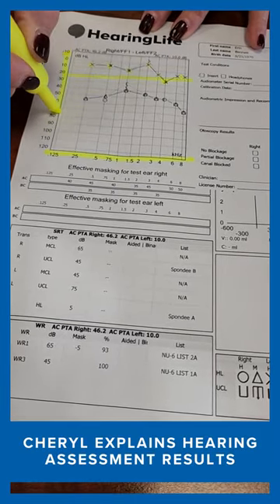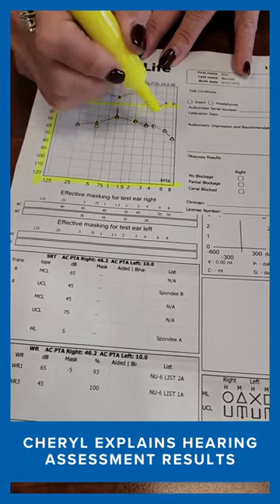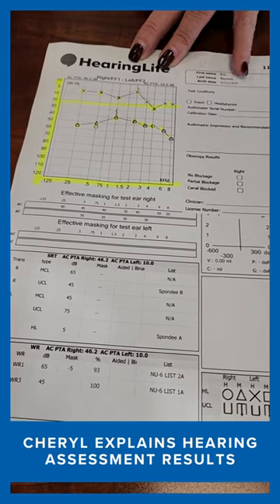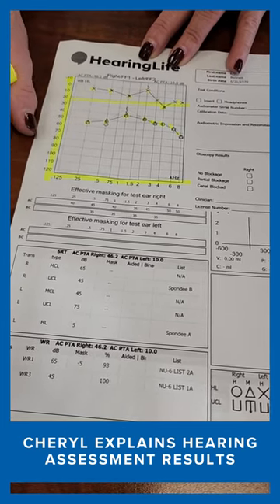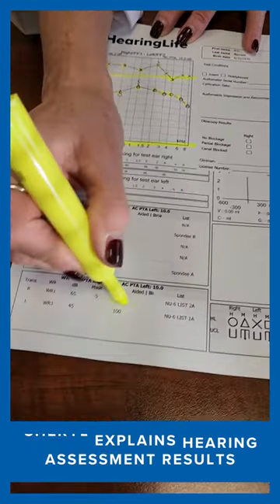It's your right ear — these are the numbers that you got a loss in. It's a moderate loss in there, but you still need amplification. The good thing is you still have the ability to make out what words are in that ear, which is good. You got 93% of the words correct.